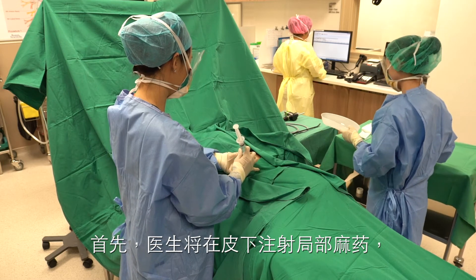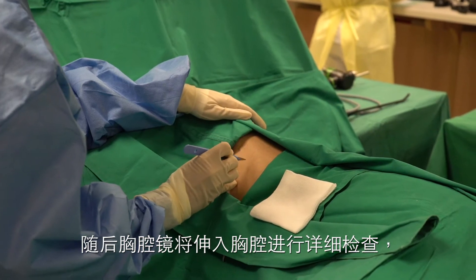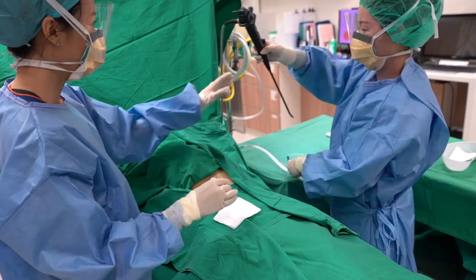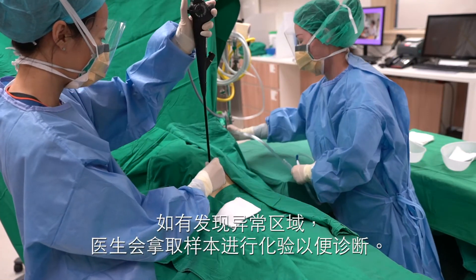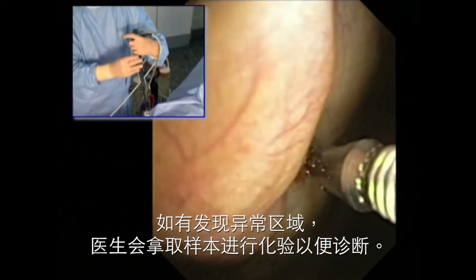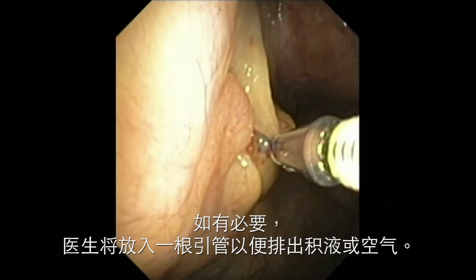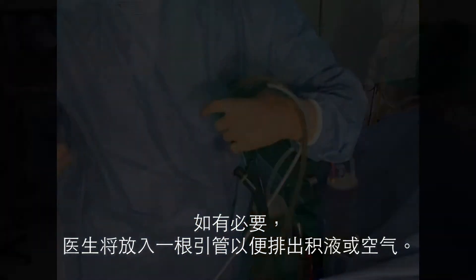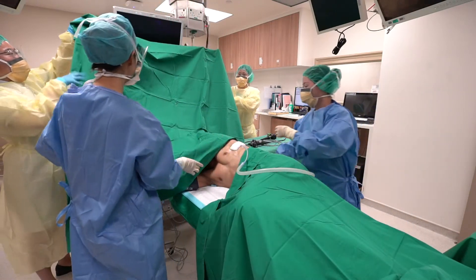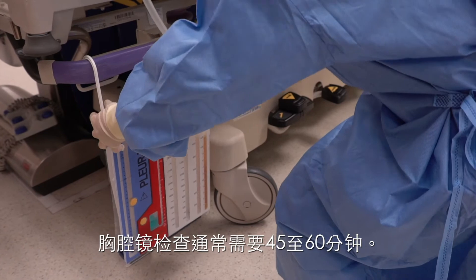Sedation will be administered through the intravenous cannula on your arm to keep you comfortable. Local anesthesia is also injected to your chest to numb the skin prior to insertion of the scope. Your doctor will examine your chest cavity with the scope, and if necessary, samples will be taken to help make a diagnosis. Your doctor may also insert a chest drain to remove any remaining fluid. Thoracoscopy procedures typically last 45 to 60 minutes.